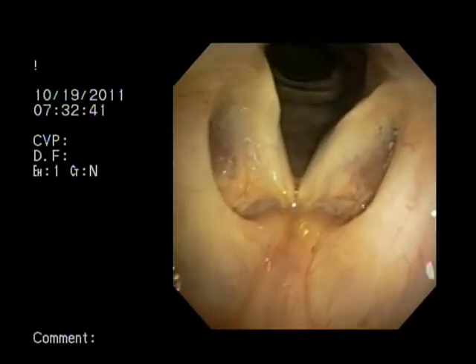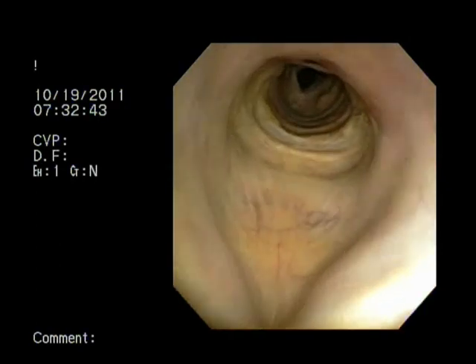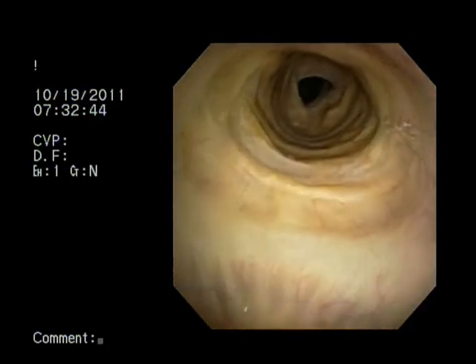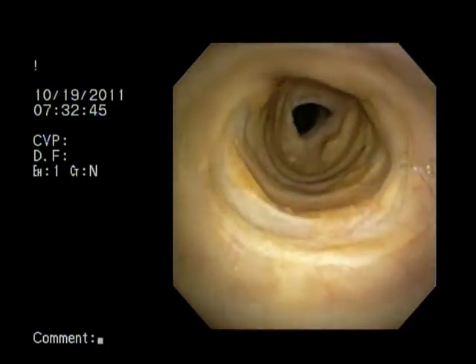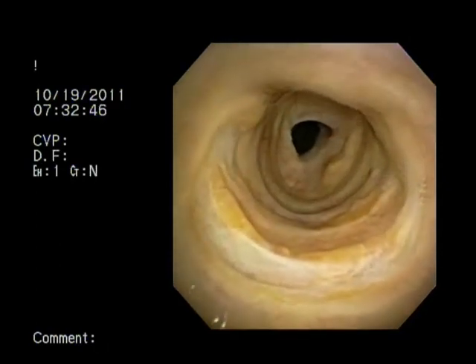The third stricture is a Meyer Cotton 2, McEffrey 1, Lano 1.